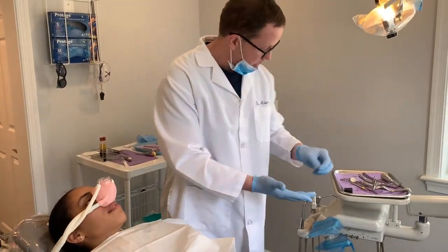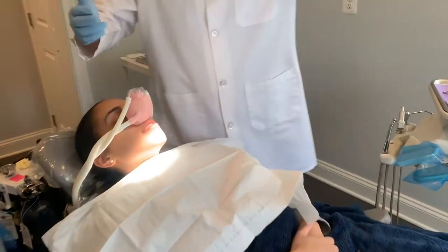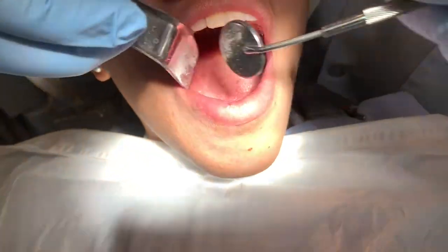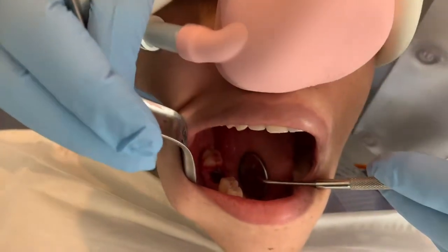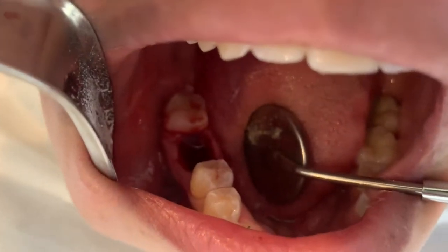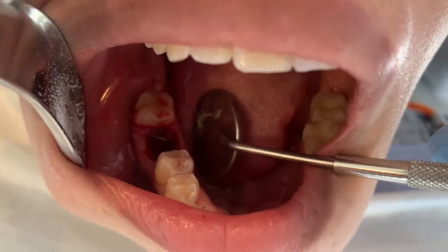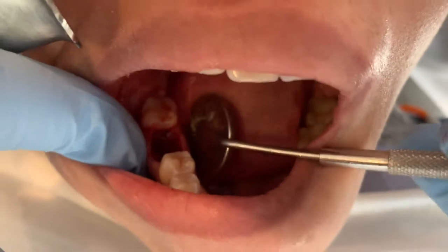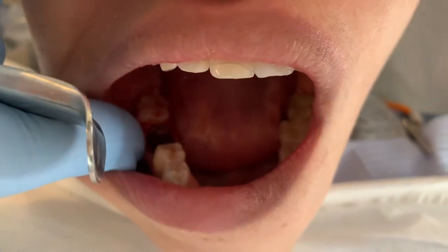So now we're at the point where we get to the most important part. Let's come over here and take a look at the tooth site. You can see that really not much collateral damage has occurred to the extraction site. We have gum tissue that has been relatively unaltered, and neither one of the next door teeth have been damaged. I can put my finger in here and feel that the bone on the front and the back are very much intact. This is really exactly the way you want things to be.